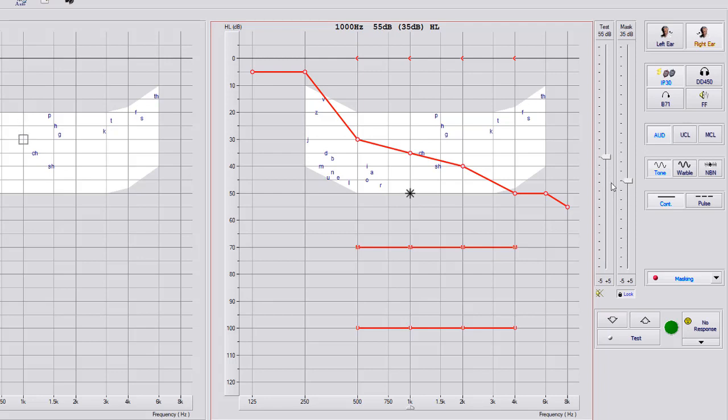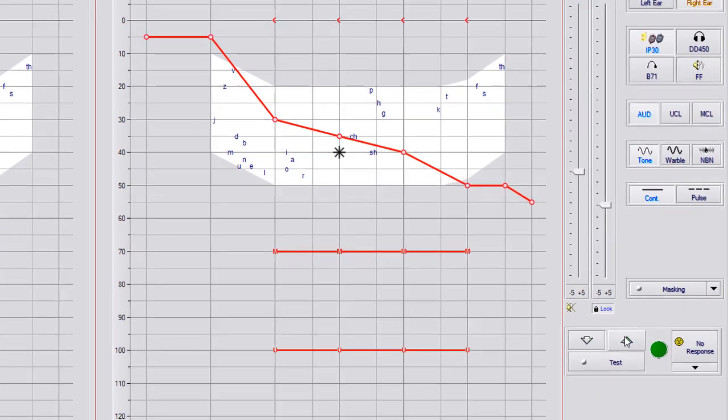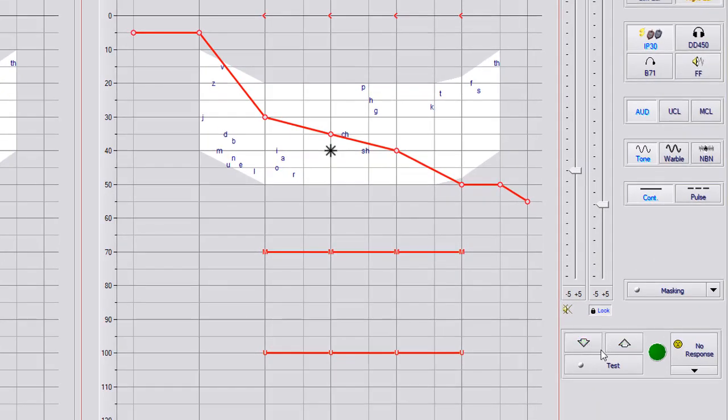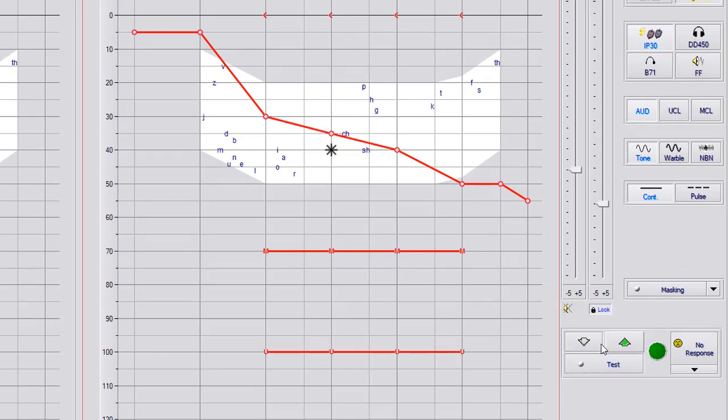If you don't want to use the keys on the keyboard, you can use the plus and minus buttons at the bottom of your slide bars. Below your masking, you have up and down arrow keys and test. This is if you want to use your mouse to do your testing.